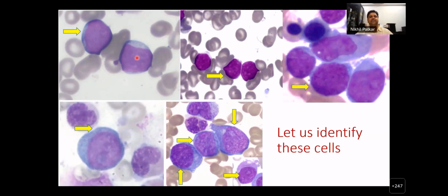So you must realize that these two cells are more likely to be lymphoid because the chromatin in here is bland. When I say chromatin, it is either open or closed. All right. So this is fine. This is coarse, relatively coarser chromatin as opposed to this, which is more open chromatin with prominent nucleoli. So these are typically seen in myeloid blasts. Now you must remember that these myeloid blasts, especially of this kind, in which you cannot appreciate granules but have prominent nucleoli.